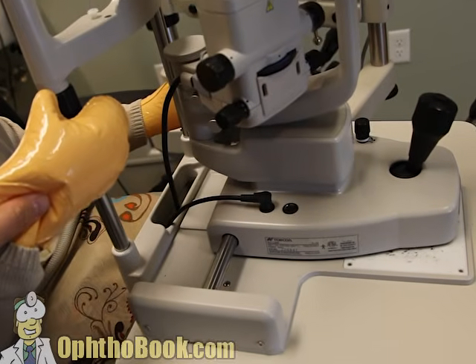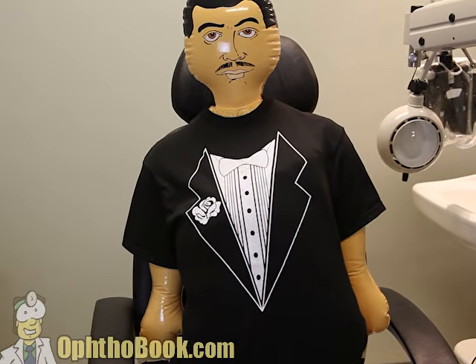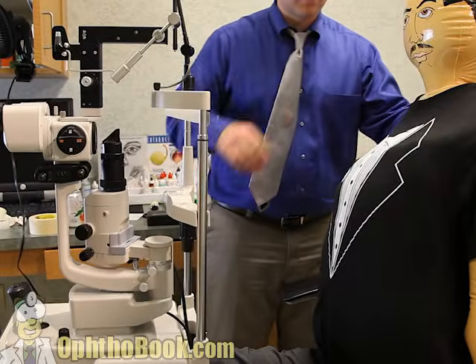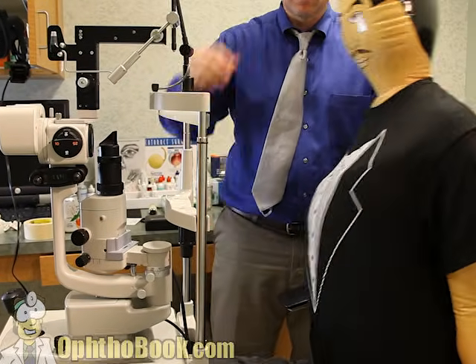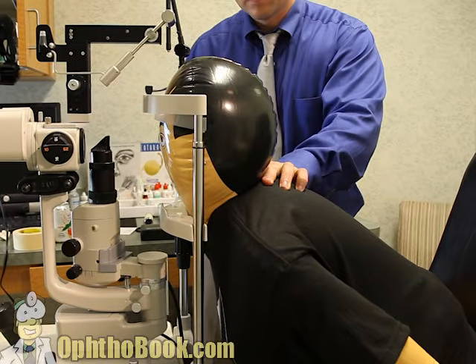The patient can grab onto the side of the table or the side of the microscope here. Occasionally you'll have a chubby patient with very large abdomen, very hard to get up to the microscope, and I find it helpful to make the microscope very low and far away for them so they can rotate down and into it. And you'll notice here that I'm pushing on the back.